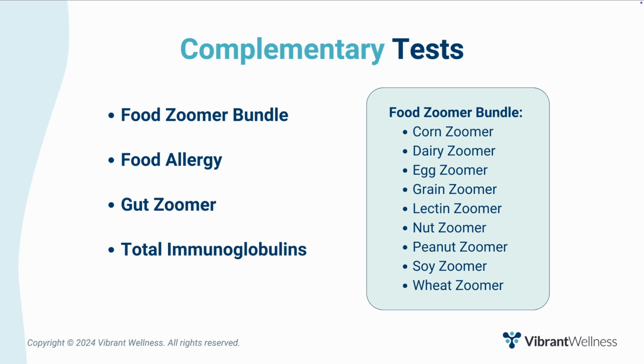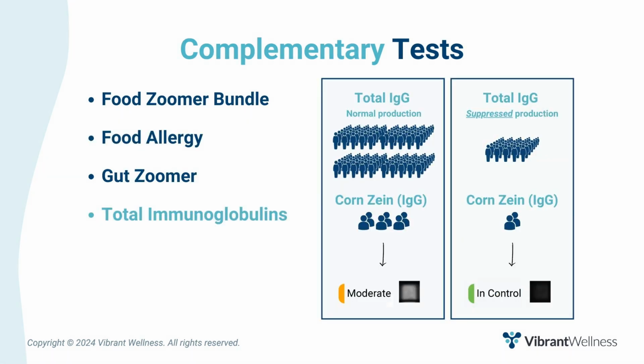And finally, total immunoglobulins to evaluate baseline levels of total IgA, IgG, IgE, and IgM. Serology testing is based on normal functional immunoglobulin production. The total immunoglobulins test assesses the number of immunoglobulins, which is helpful in those with suspected immune function compromise or those undergoing IV IgG therapy.